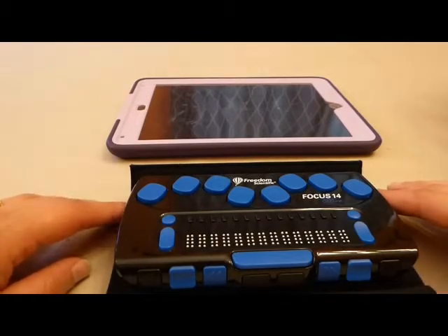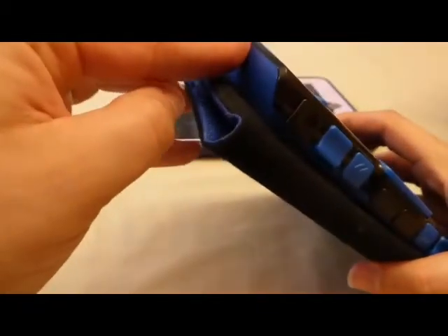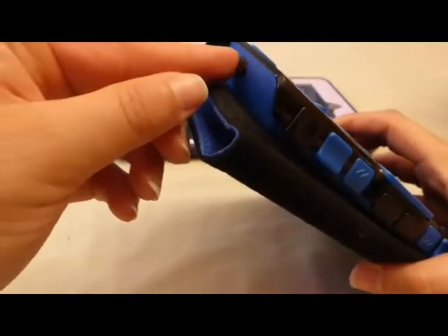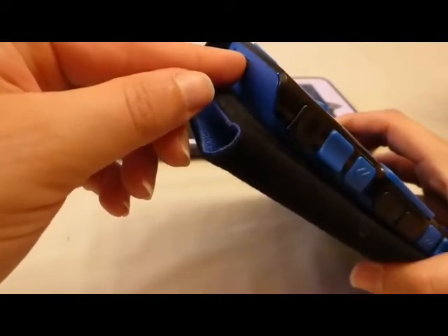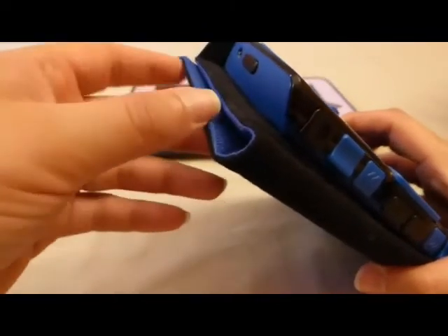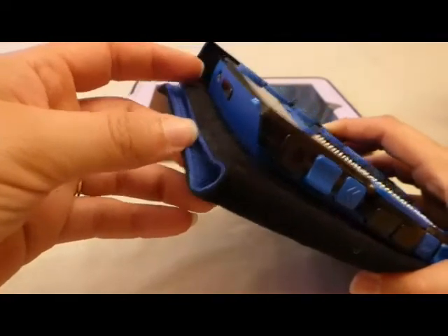First, I'd like to give you a tour of the Focus. I have a Focus 14 laying in front of me on the table. If I turn it, the left panel has a black power button as the bottom button facing closest to you on the left side. Past that, away from you, is a micro USB jack to be used for charging and for connecting to computers.